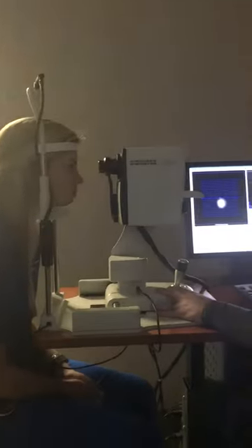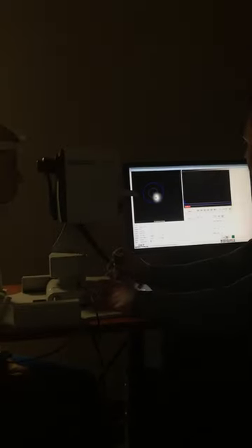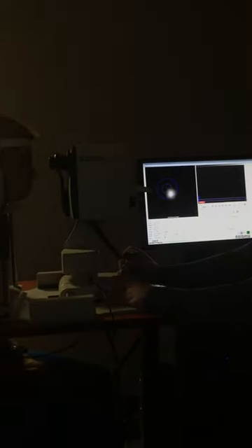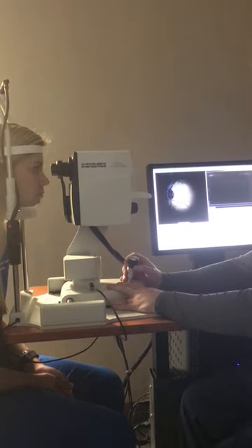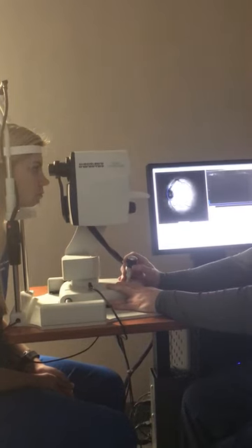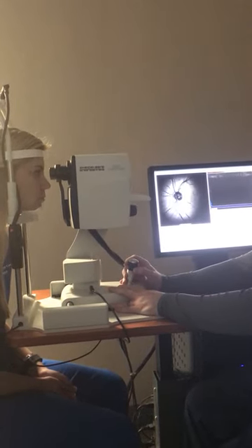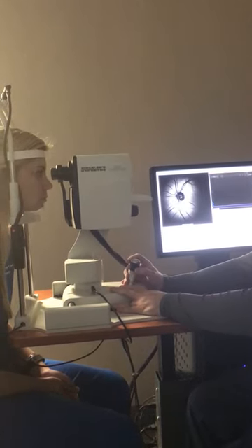Then for her left eye, it goes to TG. We'll switch now to an RNFL. The same concept. We're going to find that little circle there in the center where her pupil is, and she's looking at a blue light.